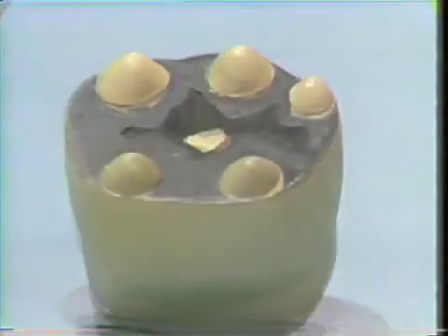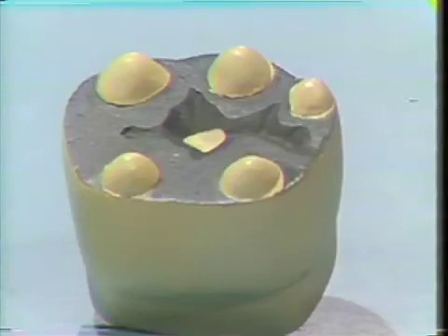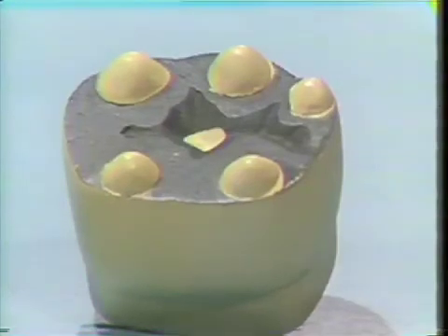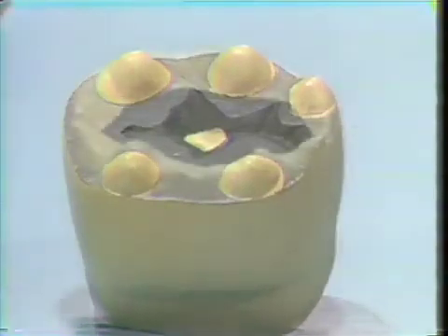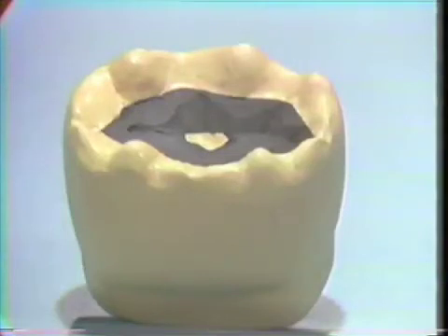The non-supportive cusp tips on the lingual aspect of the tooth are now built up, and we also have the central fossa supportive area that was indicated on the first model. Next, we see the development of the marginal ridges, mesial and distal, buccal and lingual. This encircles the periphery of the tooth and leads to the next step in the development of the occlusal anatomy.